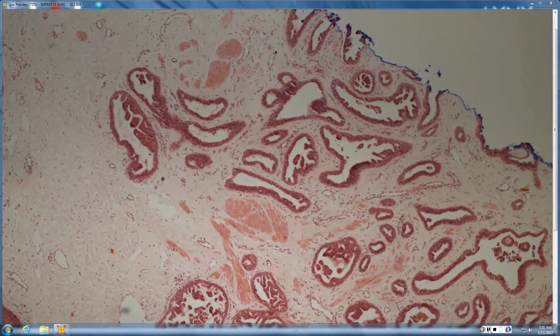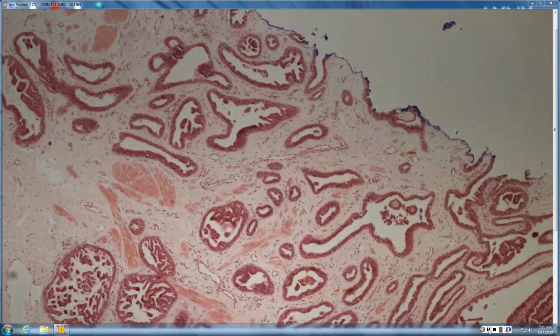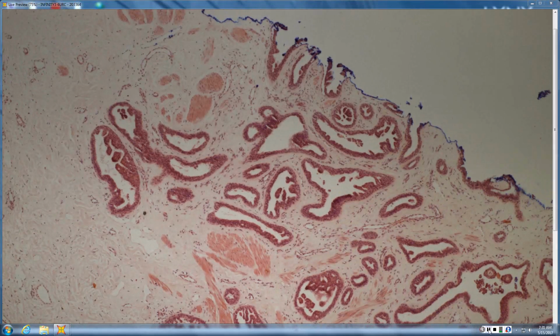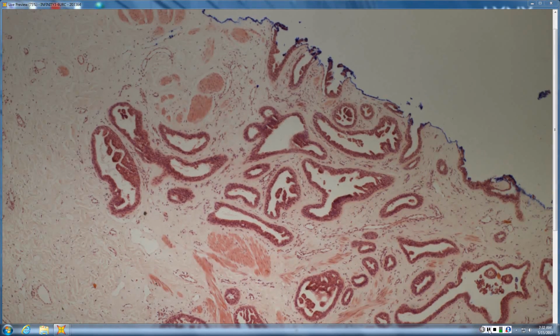Okay. So one's in focus. So first off, Shane, what do you think? Clue to anatomic site. They look like smooth muscle. Yeah, so lots of bundles of smooth muscle, kind of haphazardly arrayed. What kind of skin would normally have smooth muscle? Like genital skin? Like anogenital, which is usually smaller wisps. And then when you have bigger bundles like this, it's usually nipple. Okay. So that's a clue to breast, the larger muscle bundles like that are all smooth muscle.